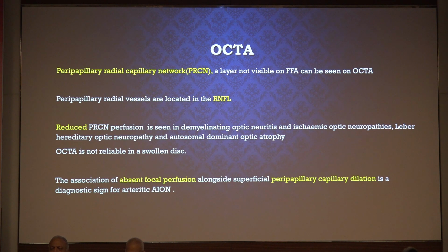OCTA, I'm not going into it, but one important thing is that this layer, the peripapillary radial capillary network, is not visible on FFA, but is visible on OCTA.